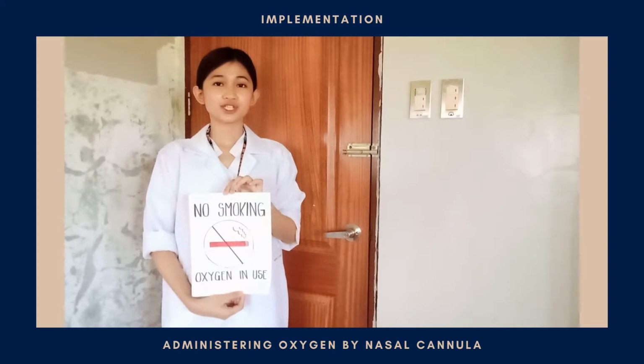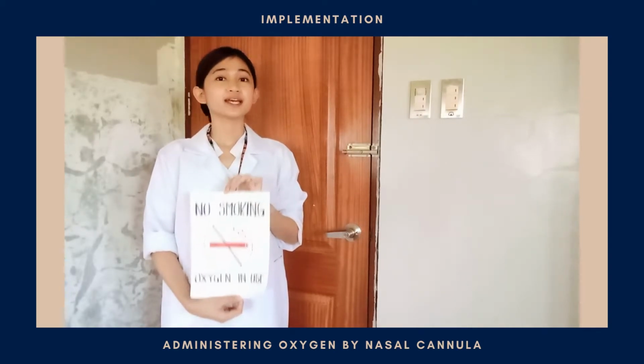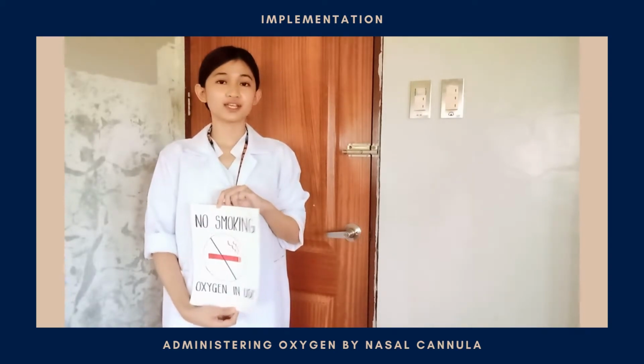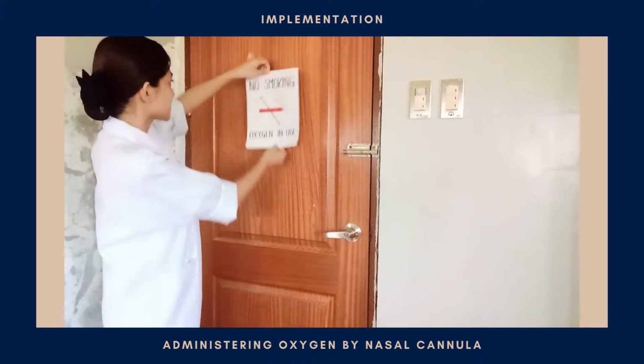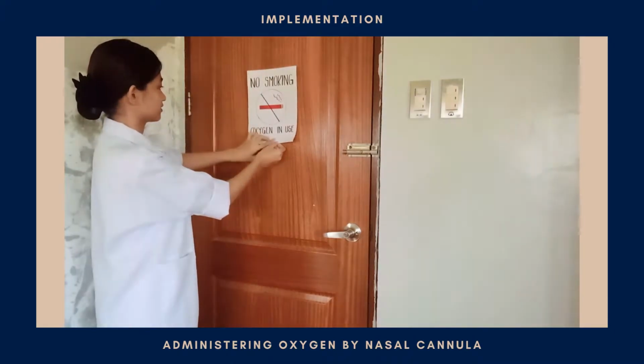Review safety precautions when oxygen is in use. Place the no smoking sign in appropriate areas. And for this demonstration, I will be placing this sign on the client's door.